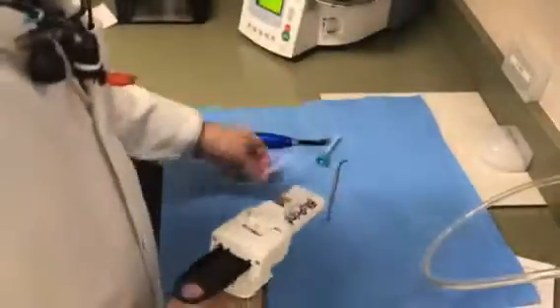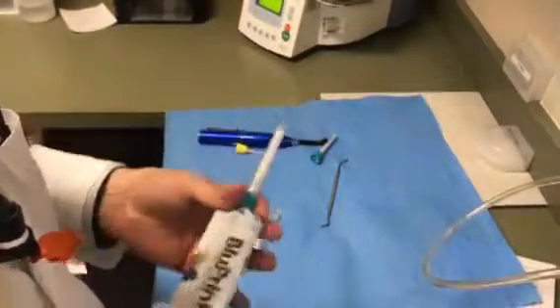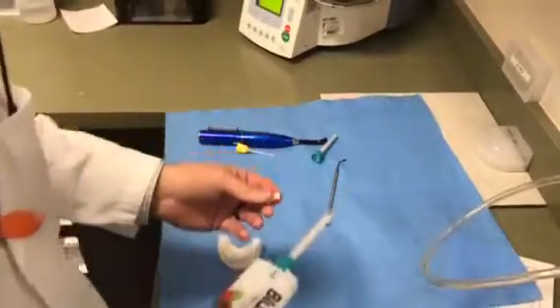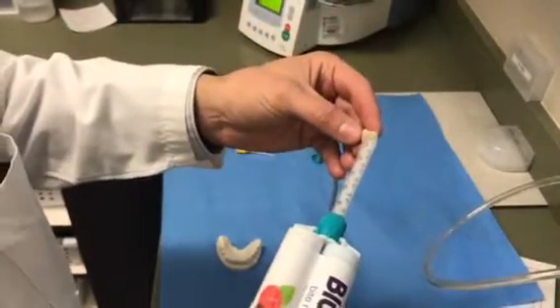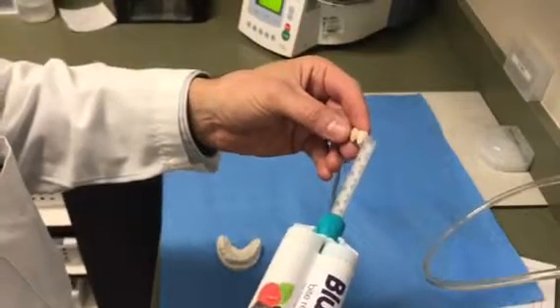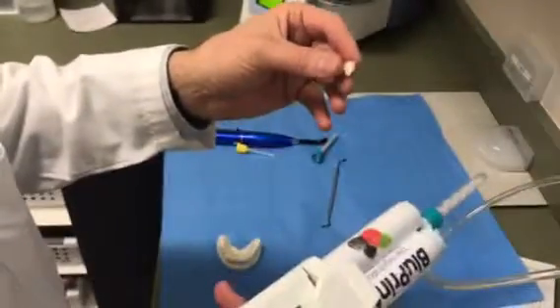If I'm in a hurry, my in-a-hurry method is that I take the bite registration material, and I'm trying to give them an idea of thickness. My goal is to show them the gap both in between and in the gingival embrasures and areas that I'm trying to show them, and then I adapt it around enough that it's kind of like a mini impression.